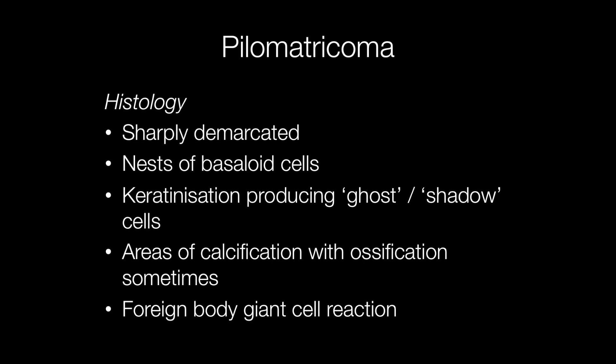Histologically, pilometrichomas are sharply defined. They are composed of nests of basaloid cells that keratinise and eventually lose their nuclei to become ghost or shadow cells. There are also areas of calcification that may, in areas, ossify, and another frequent finding is a foreign body giant cell reaction.